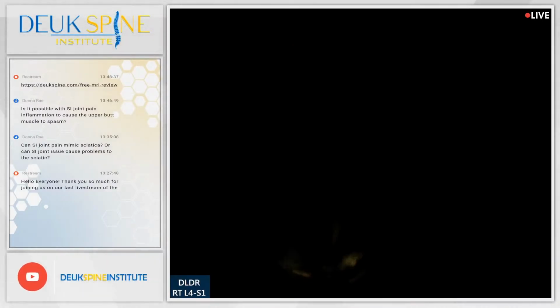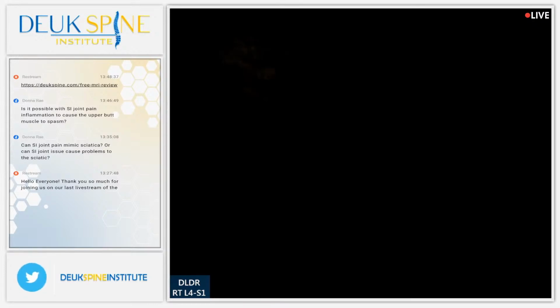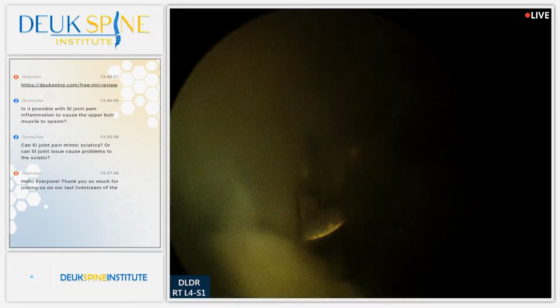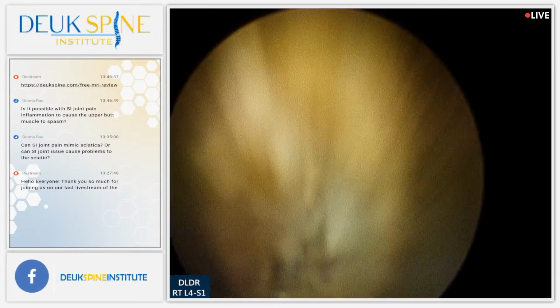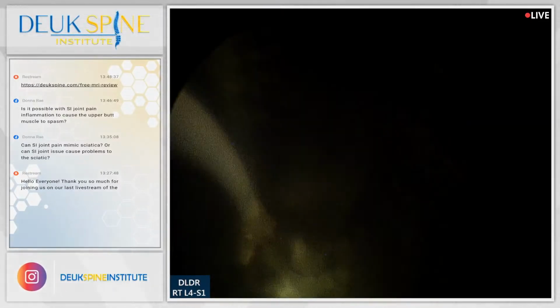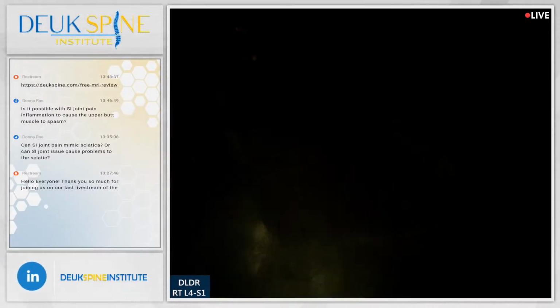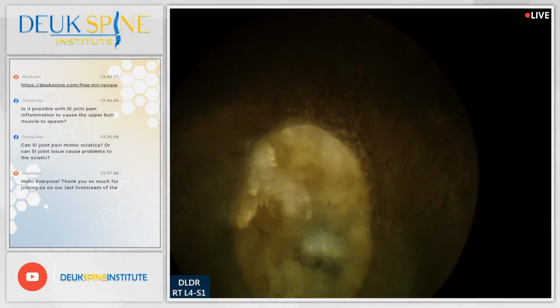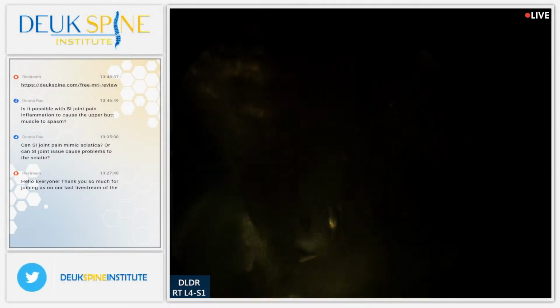We're just about finished with the second disc, which is the L5S1 disc. Now this is the more collapsed disc, but we don't care if a disc is collapsed. That doesn't cause any symptoms. Collapsing of the disc does not cause symptoms. There are millions of people out there with collapsed discs in their back, zero disc left, and they have no symptoms whatsoever, none. So it turns out that collapsed disc is not the cause of symptoms, but a lot of surgeons will tell patients they need surgery on their spine because their disc is collapsed. And basically they're just unfortunately not telling the truth.